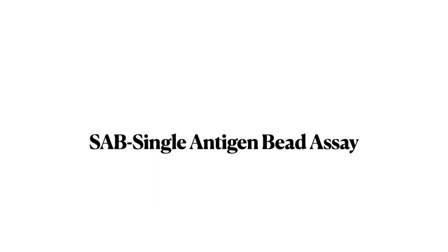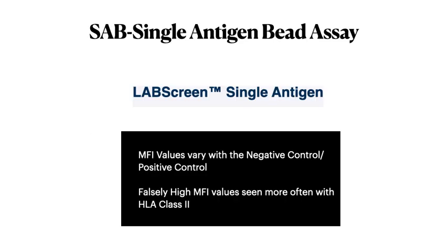So, single bead assay, again SAB. Here we need to have positive and negative controls. Again, most labs don't give this number. There are instances where I've seen that the negative control itself has very high MFI values, meaning the negative control should not have so many MFI values. When the negative alone has so much, everything will have very high values. False high MFI values have also been seen more often in class 2 HLA, so you have to be careful about this. Unfortunately, the labs don't give you this unless you have access to the lab.